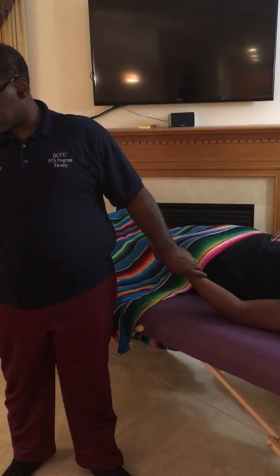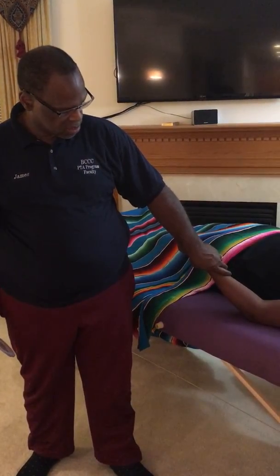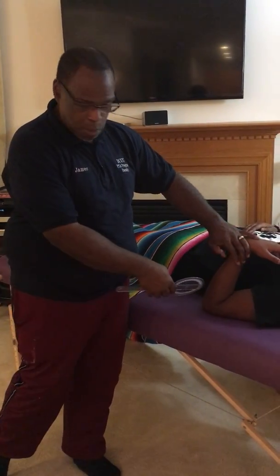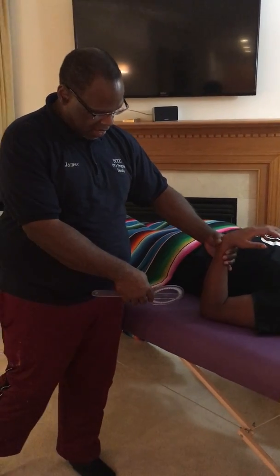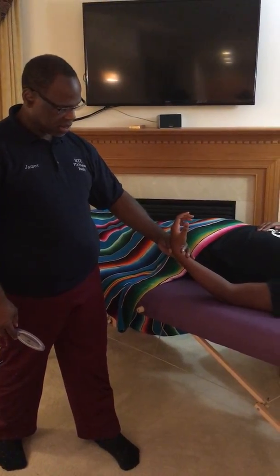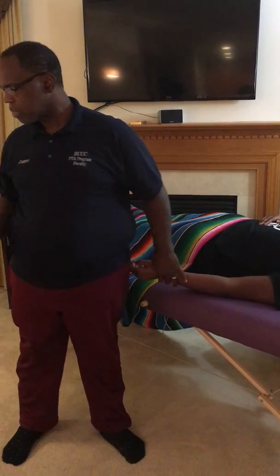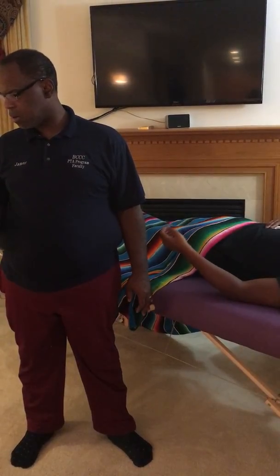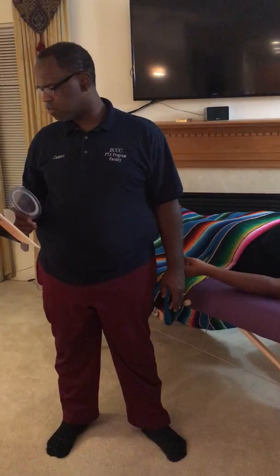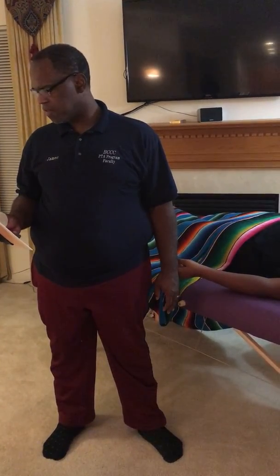Or we can say, for this example on page 14, this person can go from 15 degrees to 100 degrees of elbow flexion, and they can extend the arm to negative 15 degrees of elbow extension. Okay? Now, look at the bottom there. It says actual elbow flexion, 15 to 100 degrees, as I just said, and extension would be negative 15 degrees.